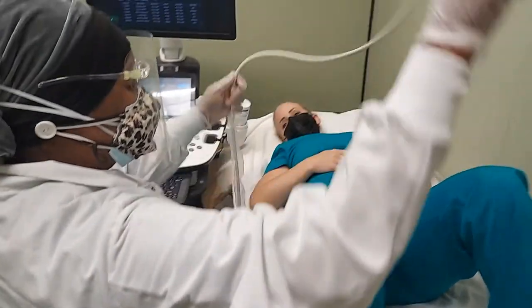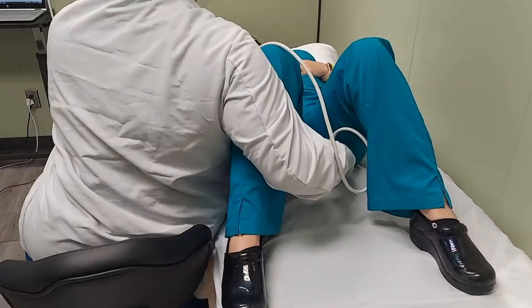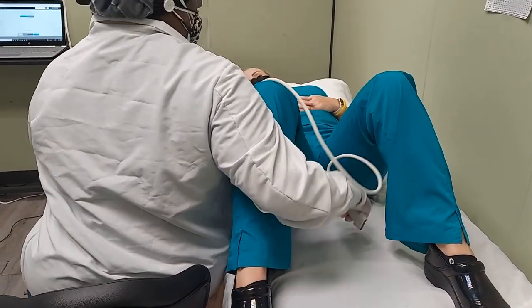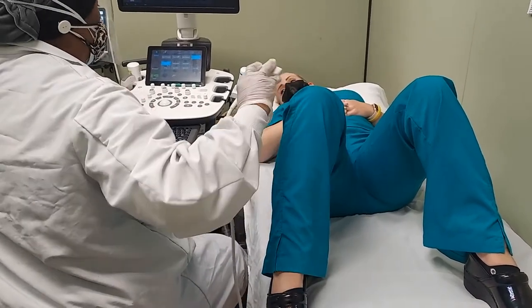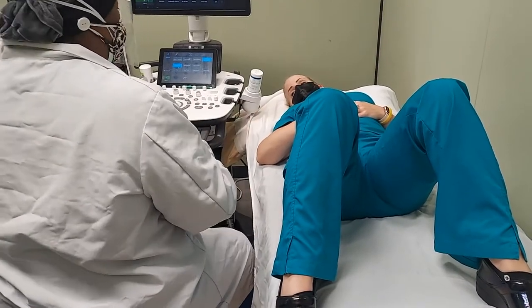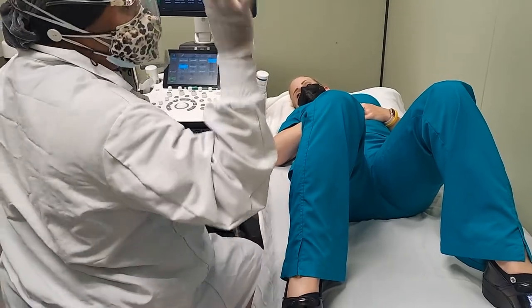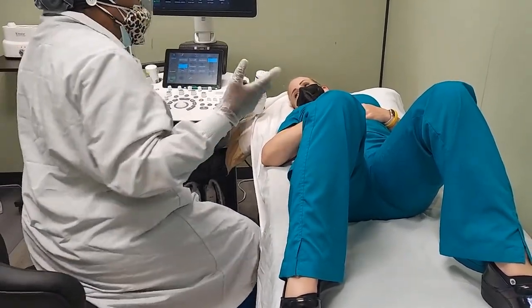On an EV patient — this is what we're discussing now — hug your arm around the patient's leg. I don't use strap stirrups at all, because when you're using a stirrup your arm is just hanging and you're moving the transducer causing a lot of tension on your rotator cuff and also your hand, like carpal tunnel.